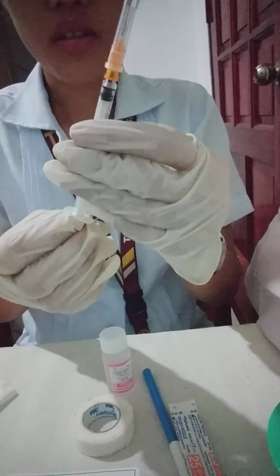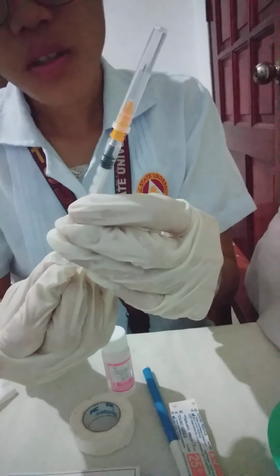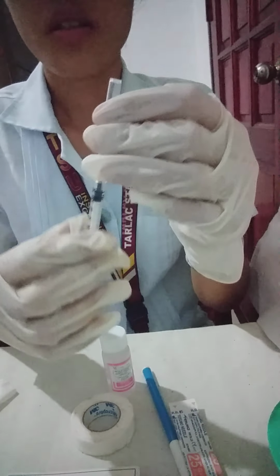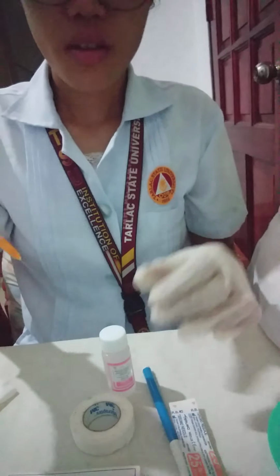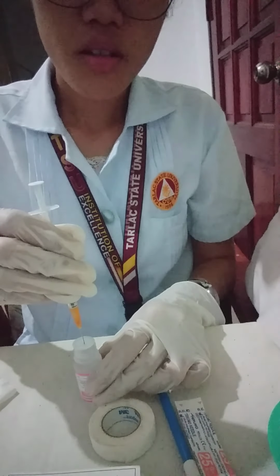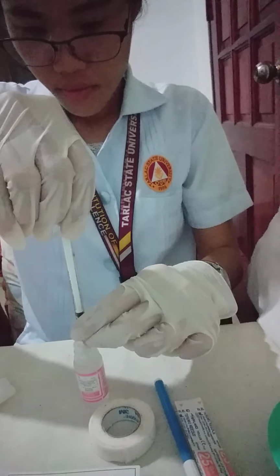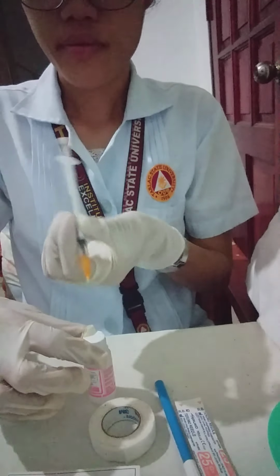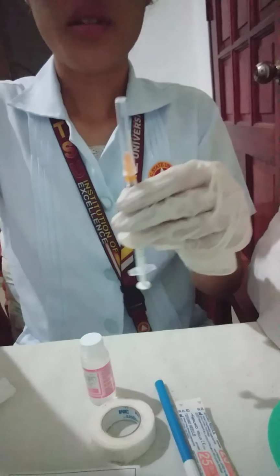We have to aspirate the syringe to the amount we prefer. The level is 0.1. And then we cover it when preparing our medications.